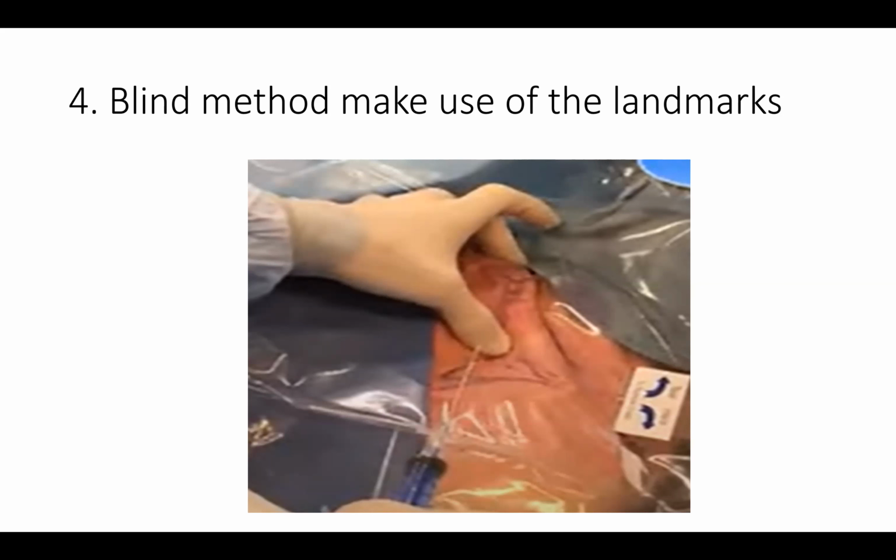Then two, there are two ways to get the blind method done. You can have an access before you create your pocket. I usually advise that. But some people are in training centers where you create the pocket before you get an access. So whatever method you are familiar with, the description is similar. But let me take the one of getting an access before creating a pocket.